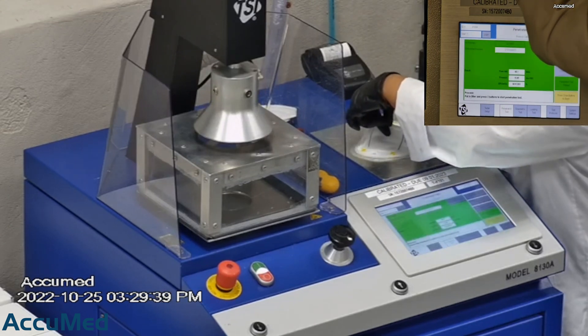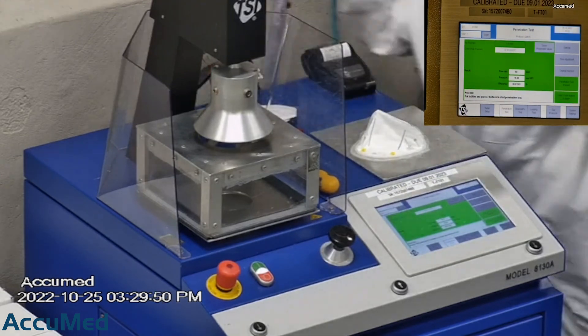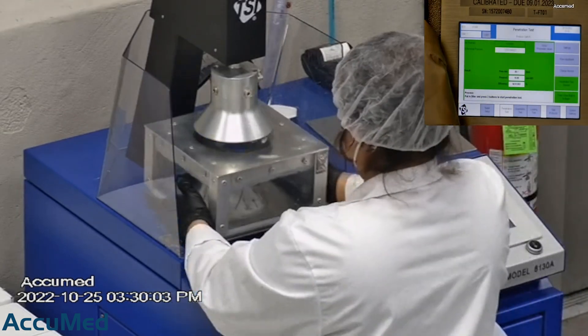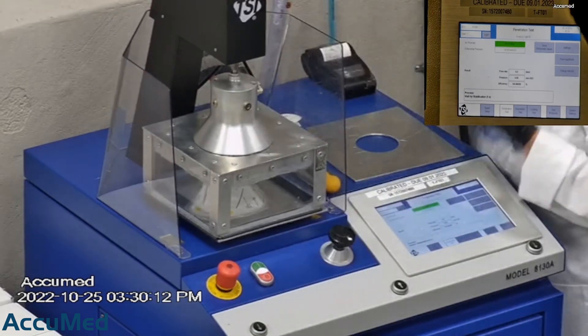F stands for airflow rate, which we test at 85 liters per minute. R is for resistance, also referred to as pressure drop. This correlates with breathability — the lower the number, the more comfortable and breathable the mask is. E stands for filtration efficiency percentage.